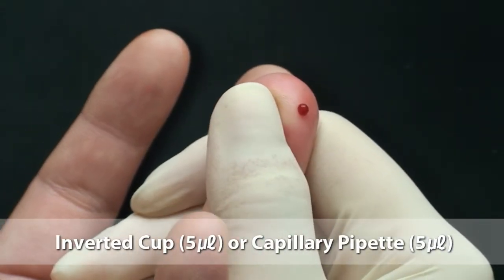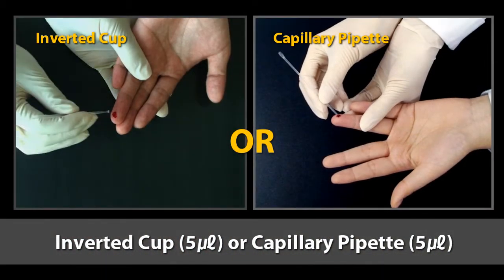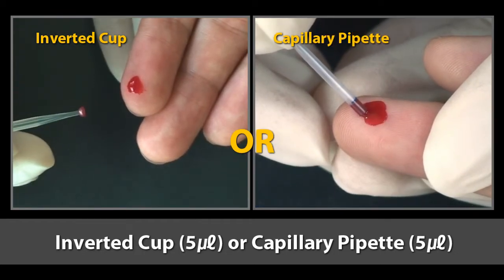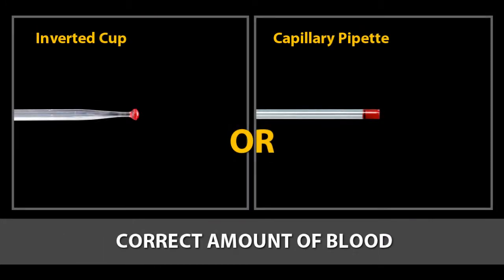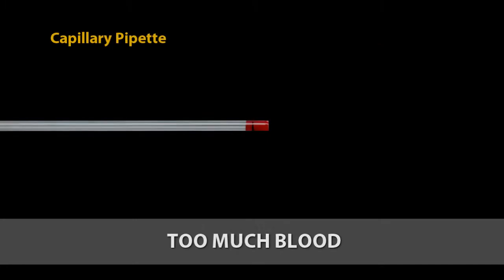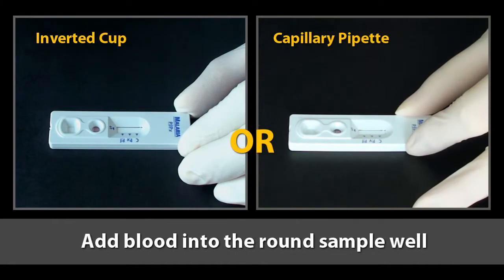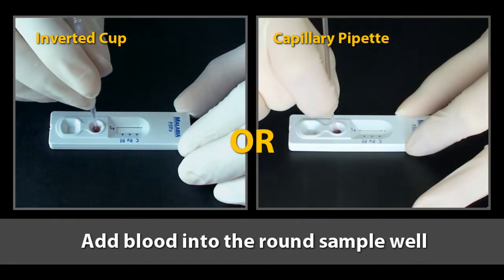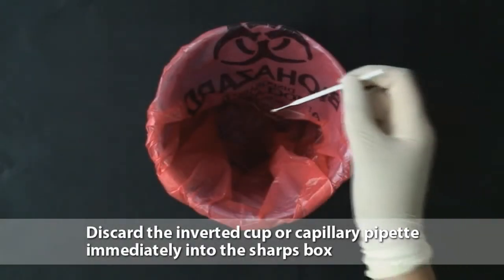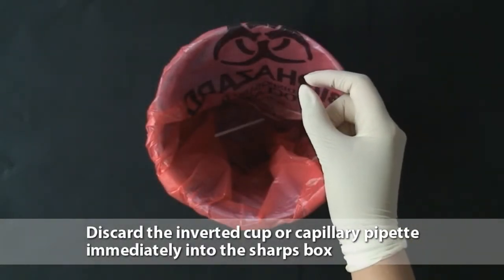As the blood bubbles up, take a disposable specimen cup and dip the circular end of the inverted cup into the blood specimen. The amount of blood collection is critical — this is the correct amount of blood; too little or too much is incorrect. Add five microliters of drawn blood into the round sample well, touching the sample pad. Discard the inverted cup or capillary pipette immediately in the sharps box.